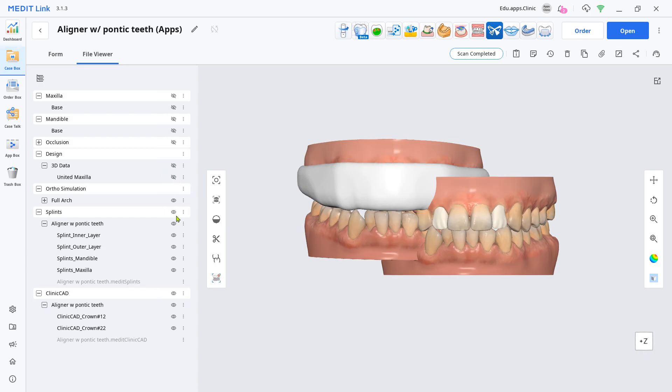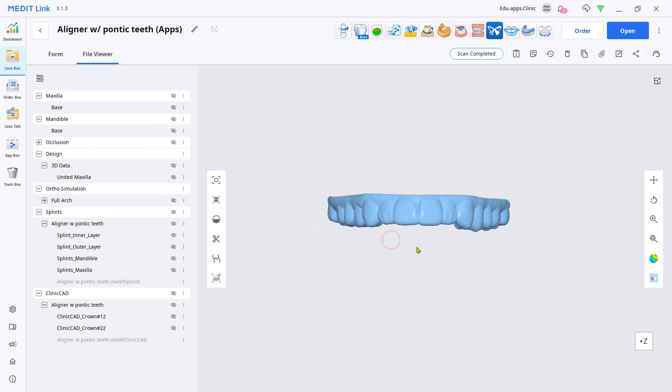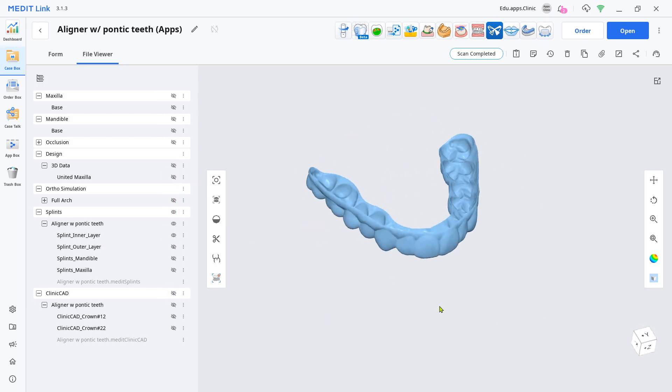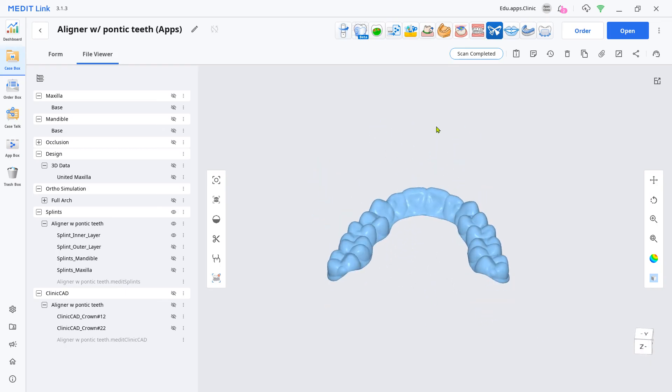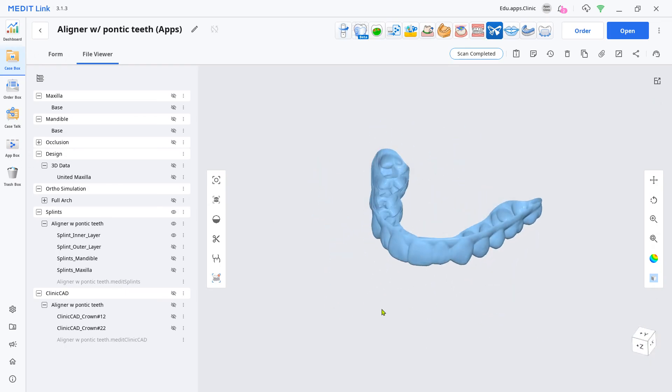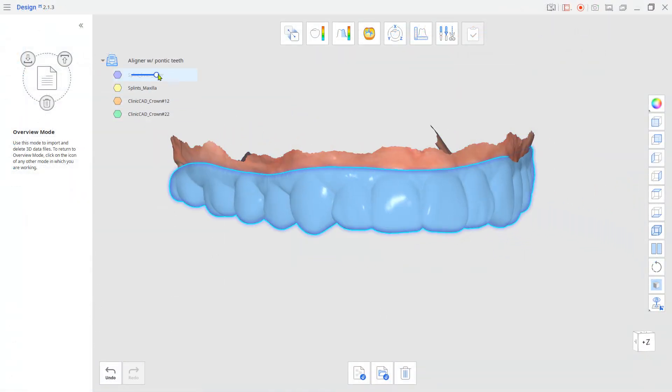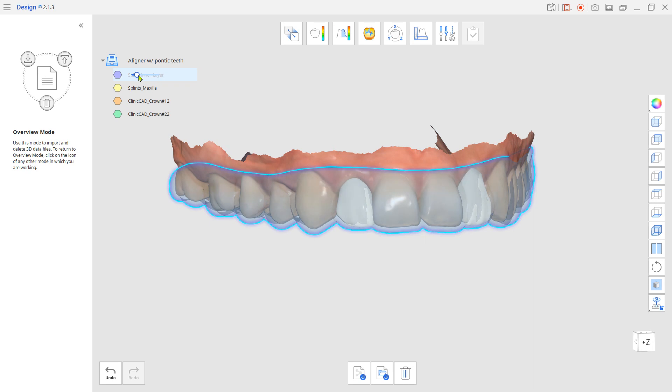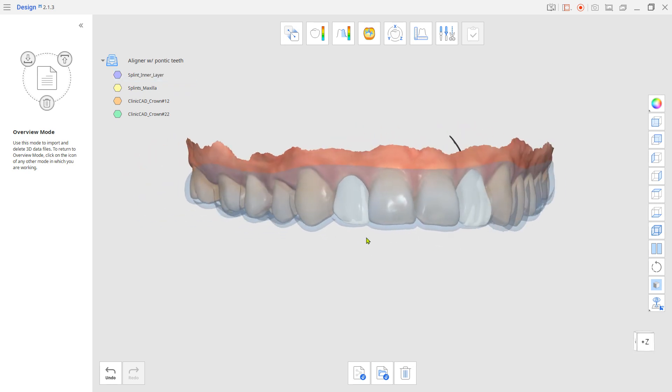Now, the created inner surface mesh will be the aligner. After 3D printing the teeth and aligner separately, bond them together to form the aligner with pontic teeth.